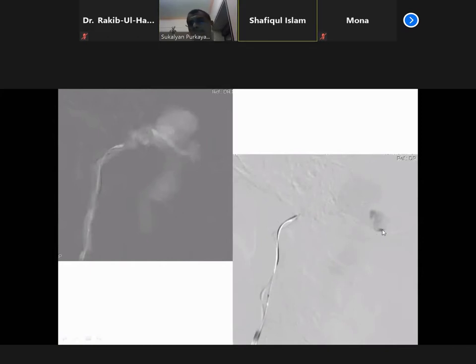And this is the area. This is quite a distally placed area. How do you know, as in the pial AVM also, how do you know that you are in the proper position? When the vein directly fills. So you need not be worried that I'm too distal. If you are not inside the venous sac, you are never distal.